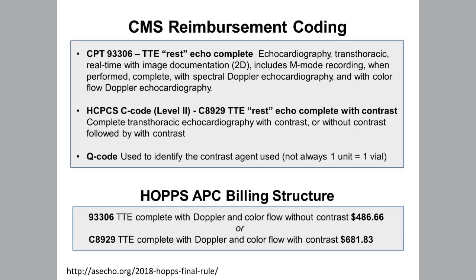And then once we've gathered that information, we'll do a full, heavier injection, where we get a nicer delineation of the compacted myocardium. That helps our doctors differentiate whether this is a true non-compaction or just a heavily trabeculated cavity.